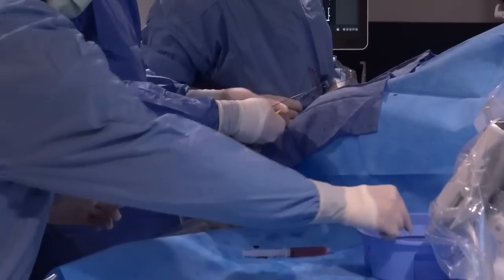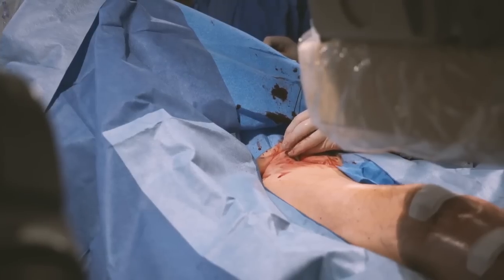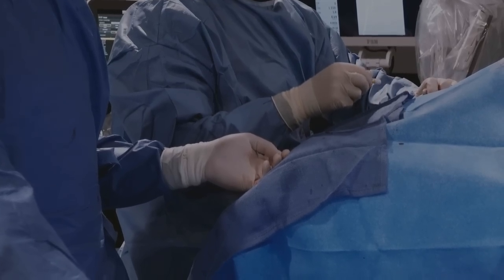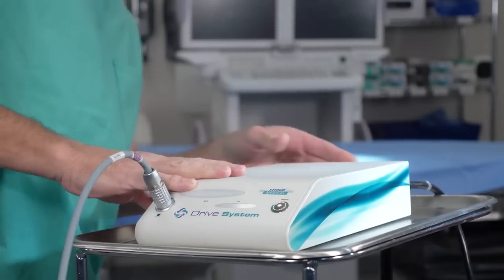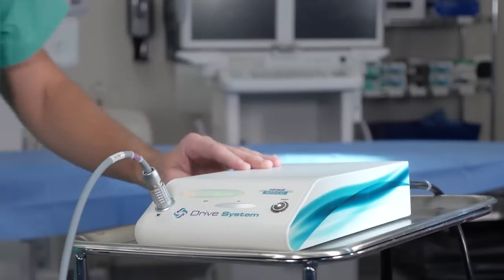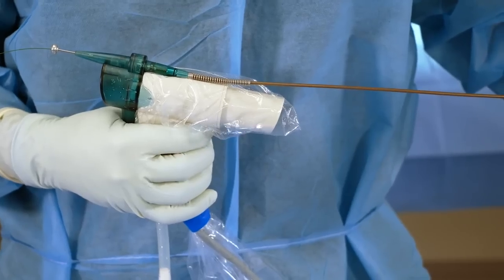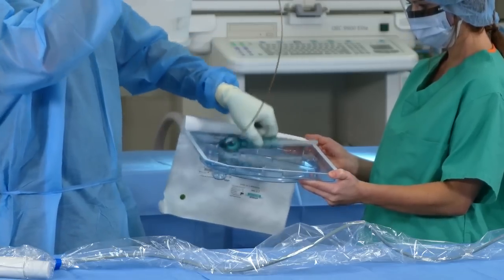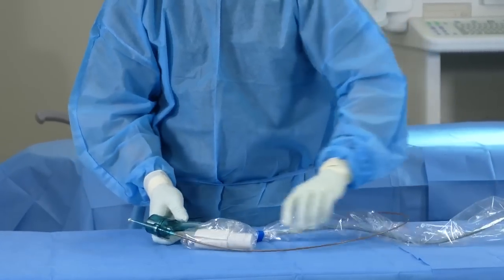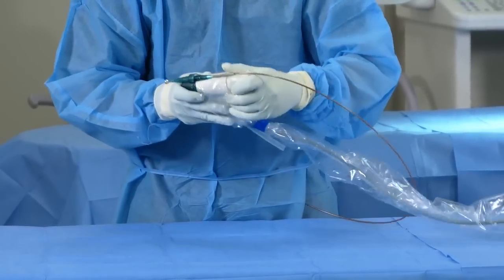At BD, we understand that anything that can help to save time, space, and reduce complexity in the lab is essential. The Rotarex system is simple to set up and easy to use, with a small plug-and-play capital component and reusable handle that is easily draped. The option of hand or foot activation gives you added control. With no requirement for cooling saline, lubricant, warm-ups, or repeated catheter clean-outs, set up and use is straightforward.